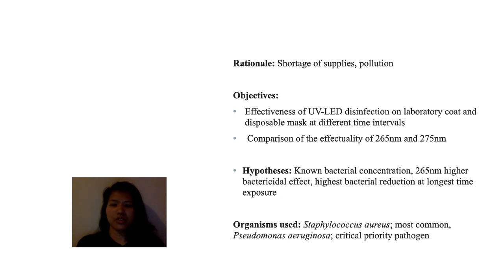The researchers formed three hypotheses. The first one would be that the known concentration of bacteria will be approximately transferred to the personal protective equipment being tested. Second is that the 265 nanometers would have a higher bactericidal effect. And lastly, that the highest bacterial reduction would occur at the longest time interval, 180 seconds.